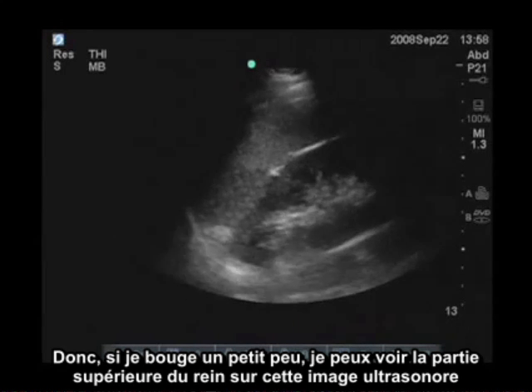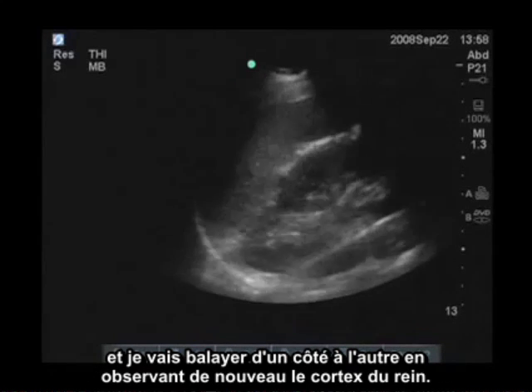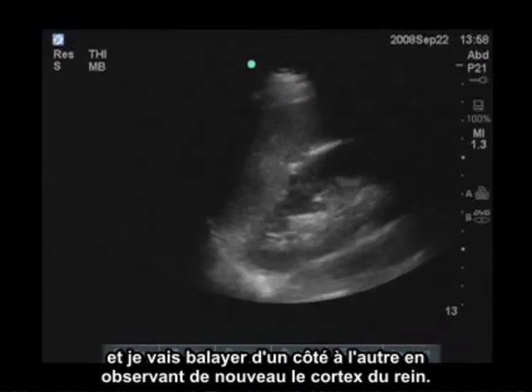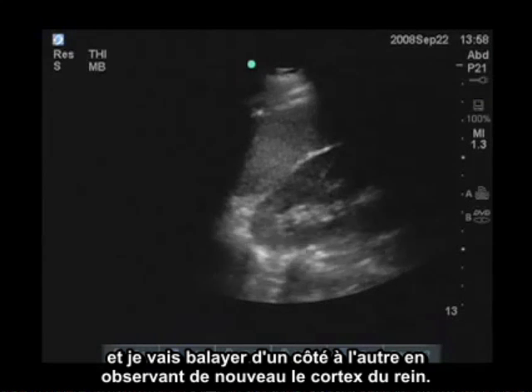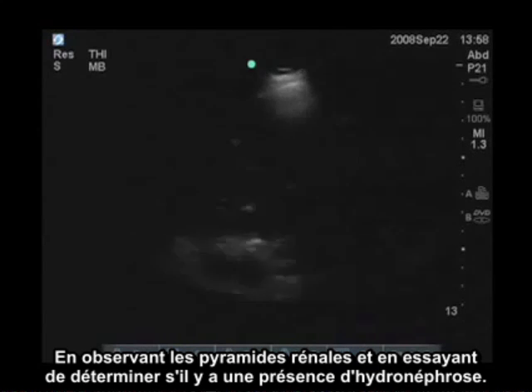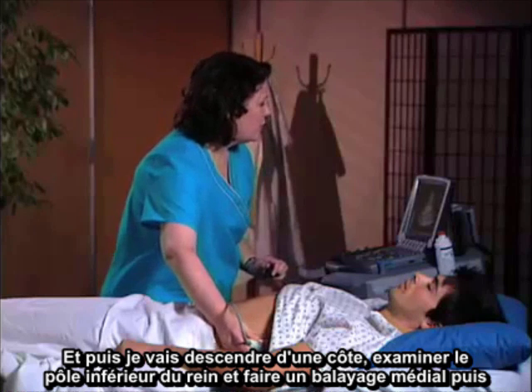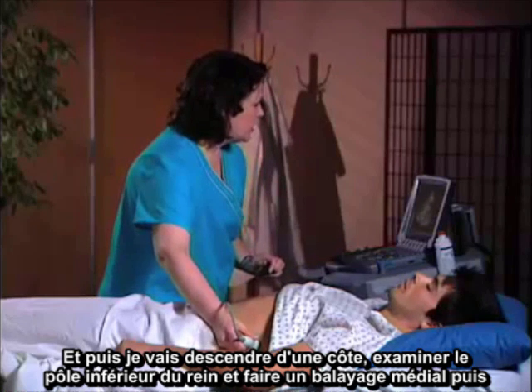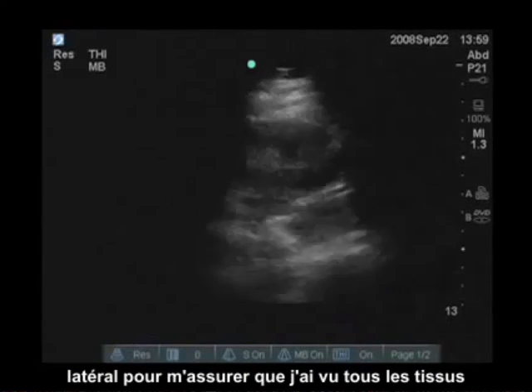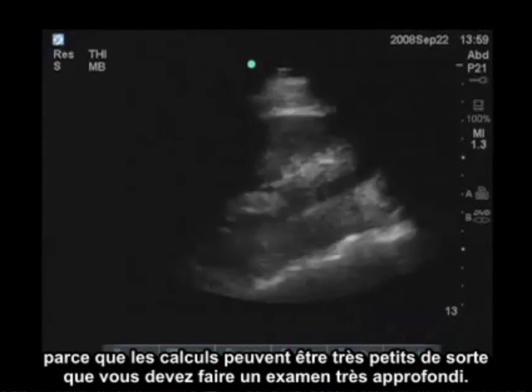If I move up a little bit, I can see the superior part of the kidney on this ultrasound image. And I'll just sweep from side to side. Again, looking at the cortex of the kidney, looking at the renal pyramids, and also trying to determine if there is hydronephrosis present. Then I'm going to move down one rib space, evaluate the lower pole of the kidney, and sweep medial to lateral to make sure I've looked at all of the tissue, because these stones can be quite small, so you have to do a very thorough evaluation.